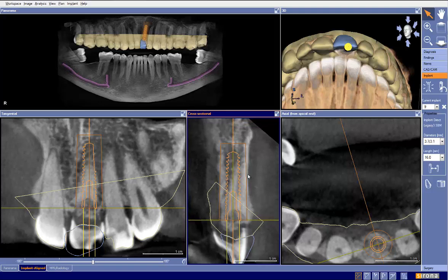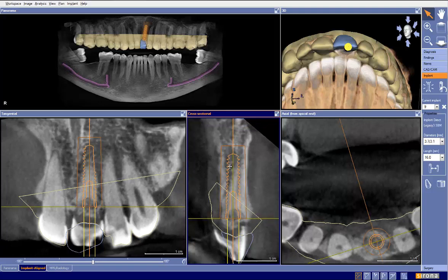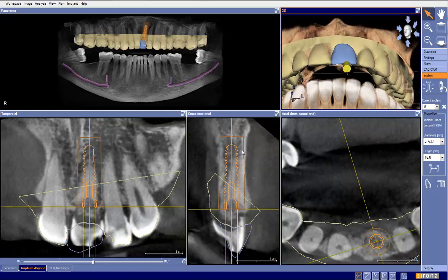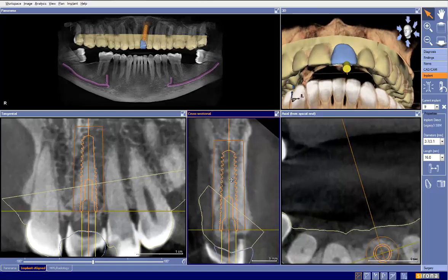The next thing I would consider is, how would this affect my osteotomy sequence? In other words, would I follow manufacturer protocol for ideal osteotomy? Or would I simply do a 2mm pilot drill and try to engage and expand the socket, assuming that this is an end cutting implant, which it is not?